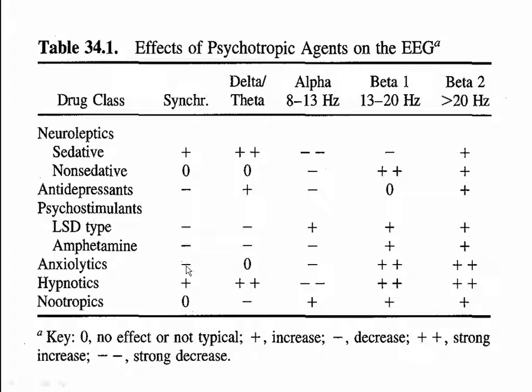Now again, back to our discussion of what language a neurologist or an electroencephalographer would use, the terms synchronization and desynchronization applied to the EEG are usually associated with rhythmic frequencies compared to lack of rhythmic frequency activity. So what do I mean by rhythmic frequencies? When you close your eyes, you have synchronous waves appearing as a result of the visual processing neurons oscillating in those slower frequencies, particularly alpha or the posterior rhythm.